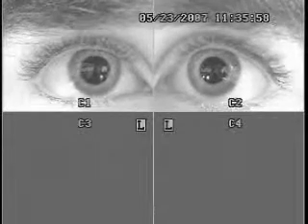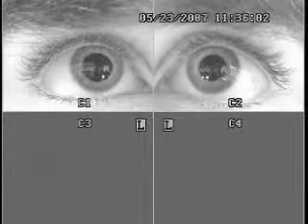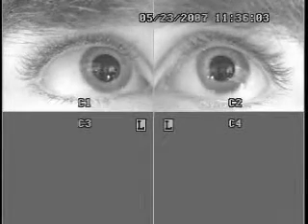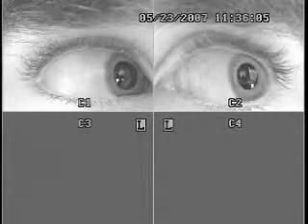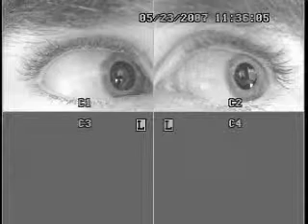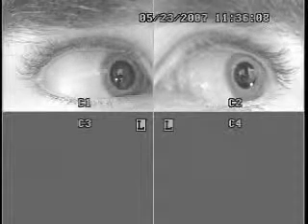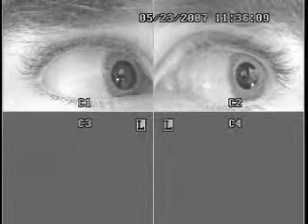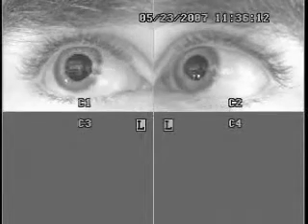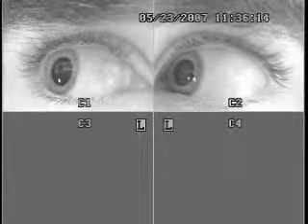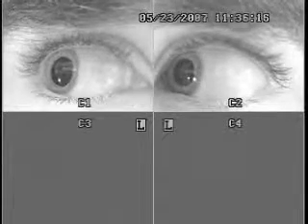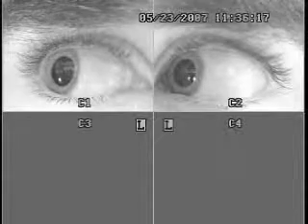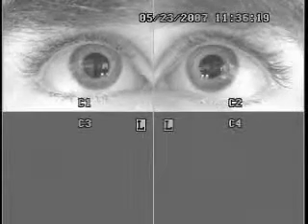Now we're going to check for distinct and sustained nystagmus at maximum deviation. Keep looking at the bead.